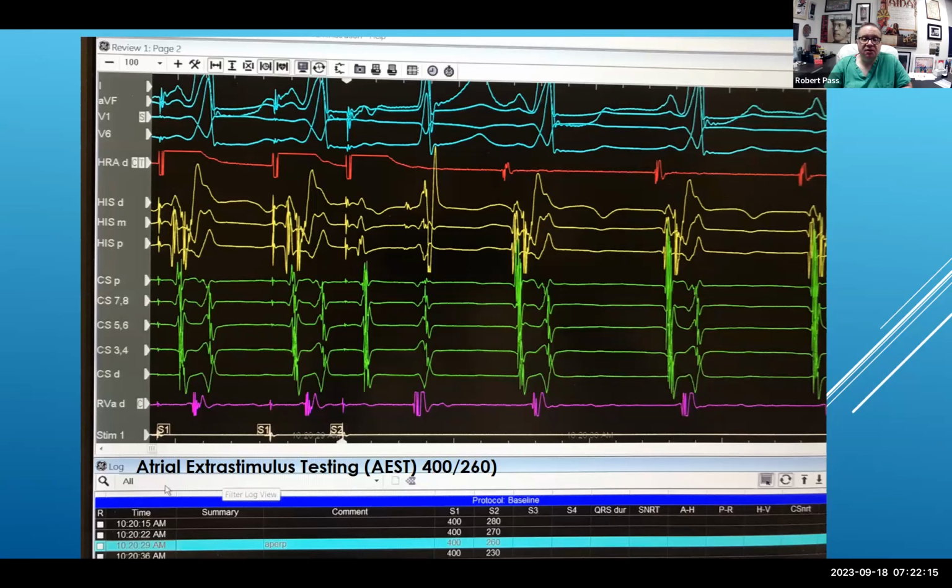Now, at this point, one could induce AFib if you are sort of in the middle here, not sure how dangerous this is, because AFib is, we think, the very best way to tell this. But I think that in this patient, I believe, was having SVT clinically, so there was no question that we weren't going to try at least to ablate this.